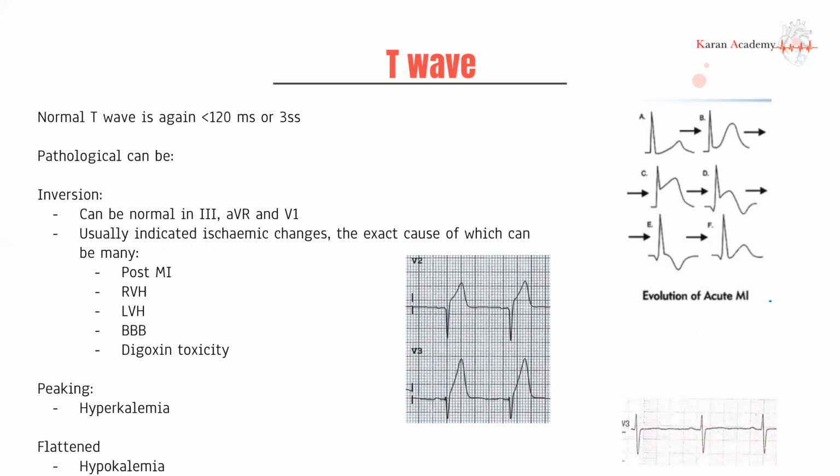Now, that may be a bit confusing. Why are we getting inversions? Well, inversions still indicate ischemic change. So why am I getting ischemic change with LVH? Remember, you have muscle that's grown without much change to the blood supply. And a person with heart disease that's having LVH probably already has a degree of vascular compromise.